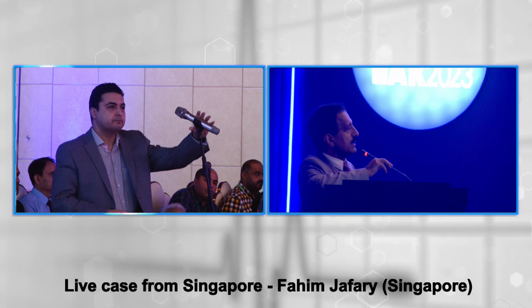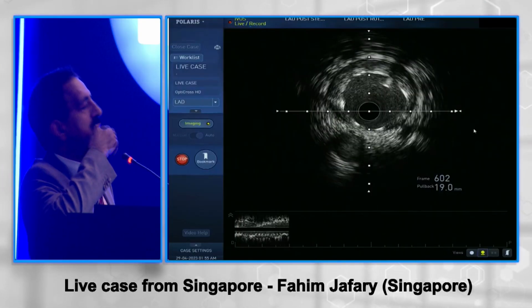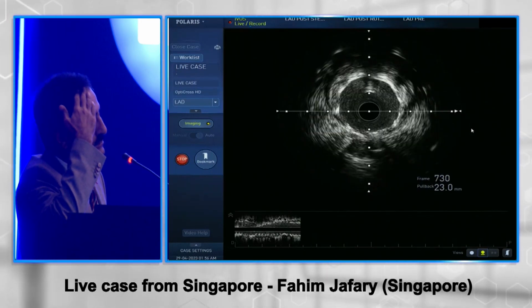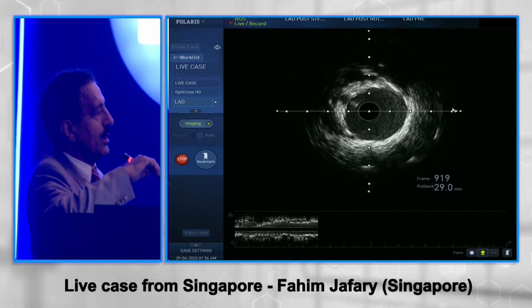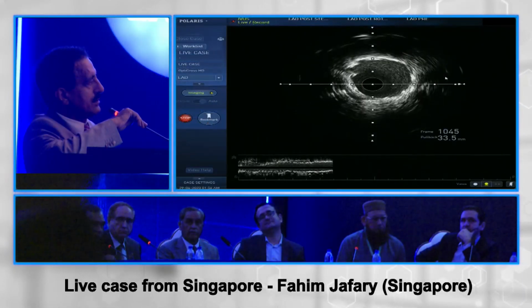The stent appears well apposed. This is what we were discussing: defining malapposition requires OCT. OCT costs 4.5 lakh rupees for a catheter. 99% of the labs in Pakistan don't have OCT, and 90% don't have IVUS. So what you are dependent on is angiography.